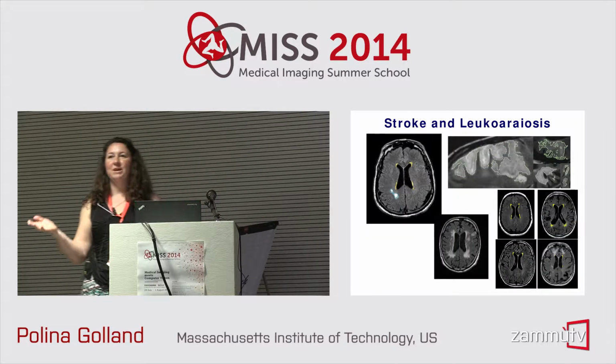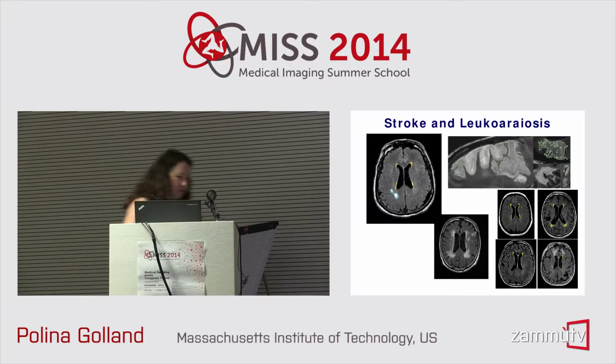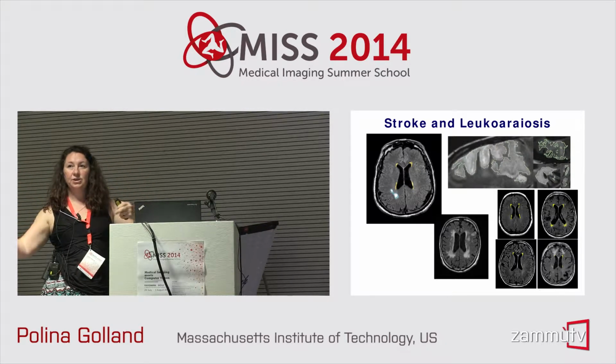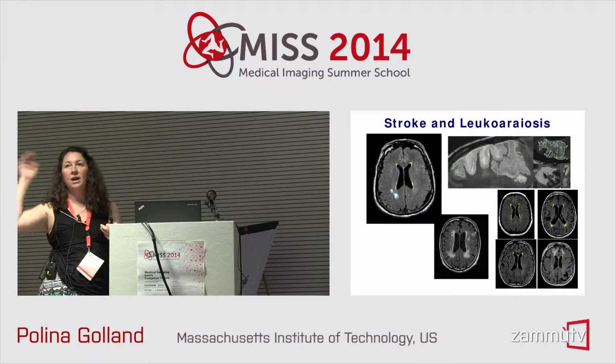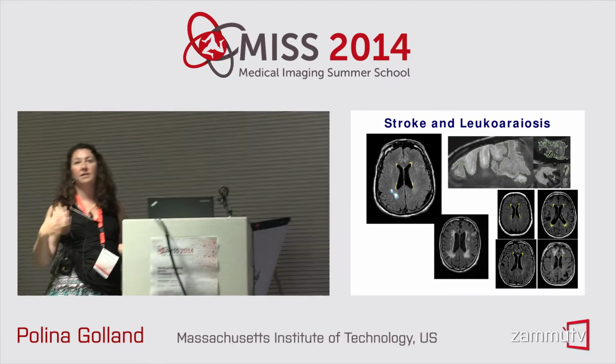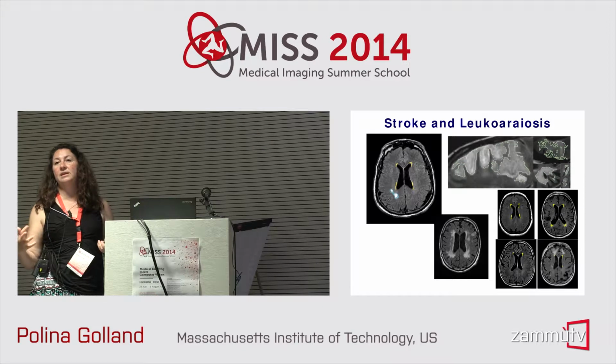I assume that not many of you have seen stroke images, so let's just understand what the problem is. The image on your left is an axial image of the brain of a patient who is going through an acute stroke phase, meaning that it's within 48 hours of the onset of stroke. This is part of a very large, multi-institutional study of stroke, trying to understand the genetic causes of stroke. But what we're looking at are so-called T2 FLAIR images.